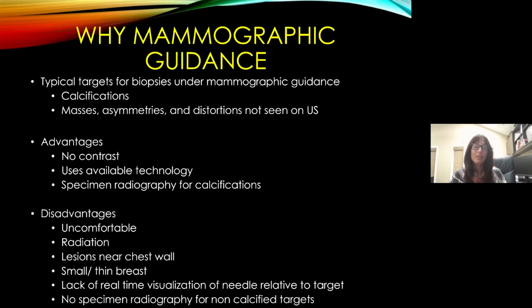There are some advantages for using mammographic guidance. It does not require contrast. It uses available technology. In fact, there are some mammographic-guided machines that are add-on to a typical mammogram unit and don't require a special room.